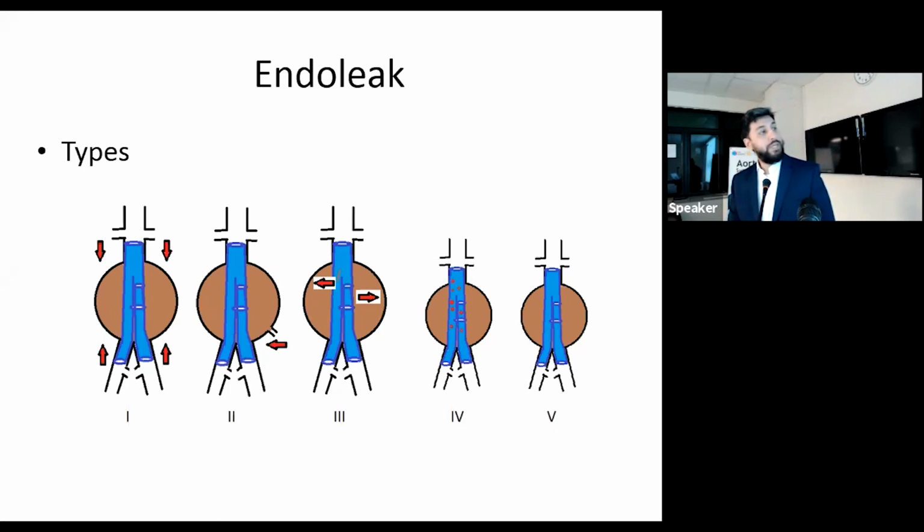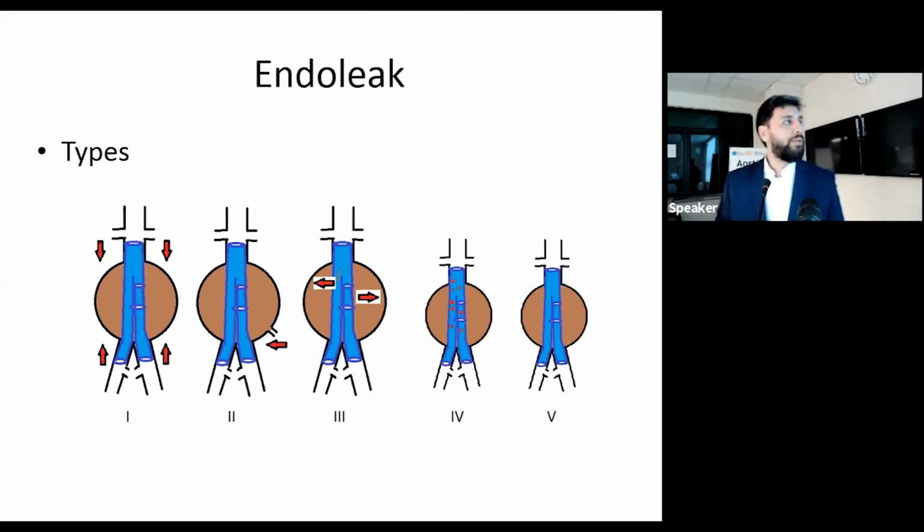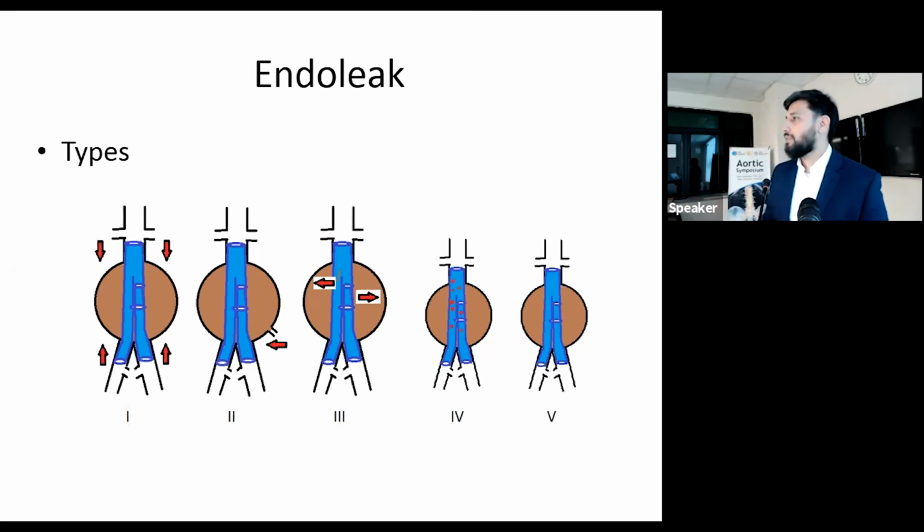A type 2 endoleak is commoner, but usually less of an issue. It is basically where you have reverse flow or backflow from a branch artery. There are lumbar arteries that we don't close here. Usually we don't occlude the IMA, and sometimes there can be retrograde flow through those arteries that starts filling the sac, and the sac can be pressurized.